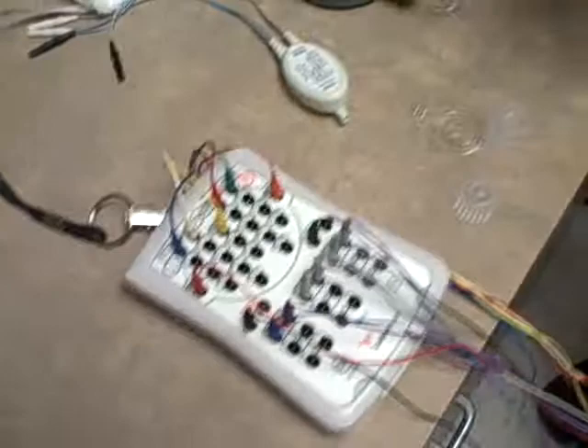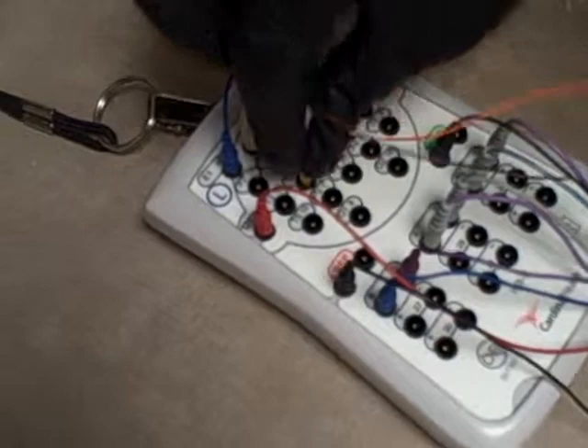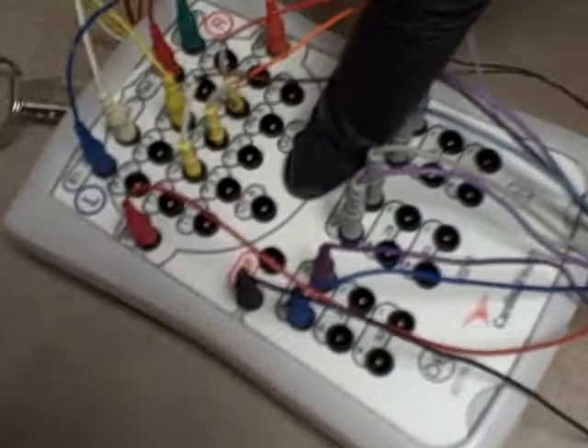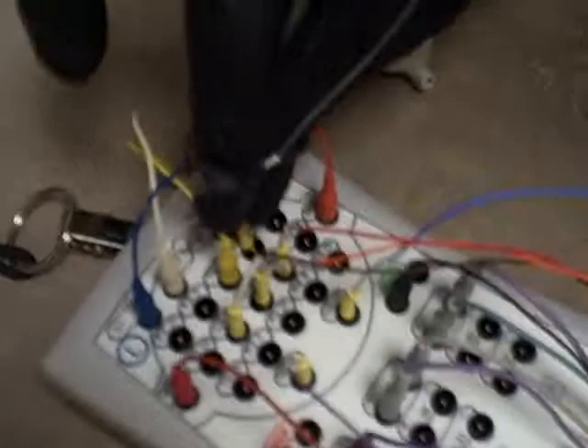The remainder of the plugs are the gold cups that we placed on the patient's head. This is CZ — the center of the head. Coming down 20% to the left side of the head is also labeled here. This section at the back of the head also records the eyes — his left eye and right eye. Then traveling back to the front of the head, this is the right side of the front and the left side of the front.